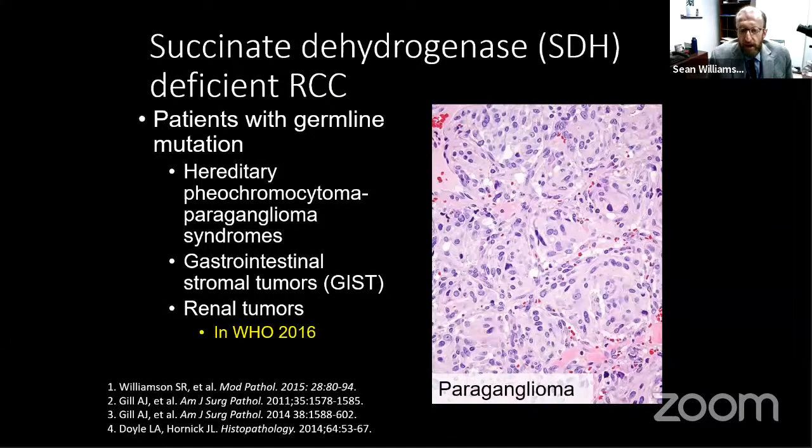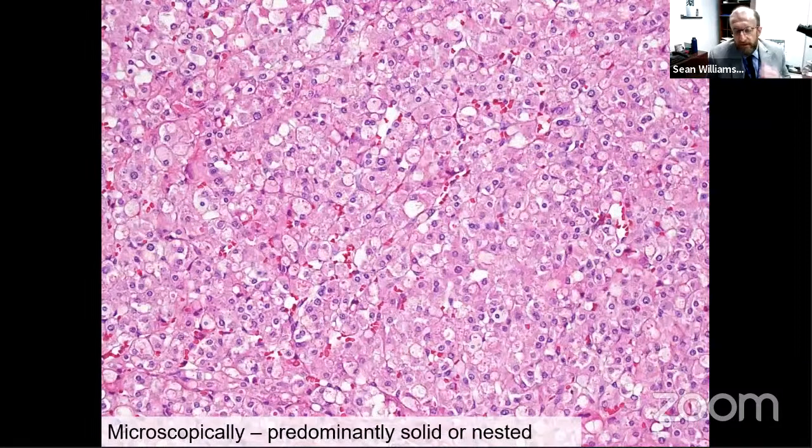Another entity that's perhaps not as new and emerging as those that we just talked about, but also relevant to the oncocytic tumor spectrum, is succinate dehydrogenase deficient renal cell carcinoma. SDH deficient renal cell carcinoma is, of course, now included in the WHO classification since 2016. So this is less of an emerging entity and more of a recently established entity. But the helpful diagnostic features to recognize these tumors are that they have, again, very monotonous eosinophilic cells. They have cytoplasmic vacuoles, as you can see here.